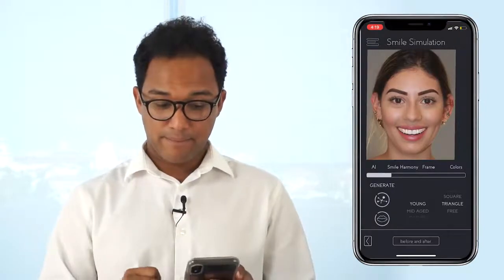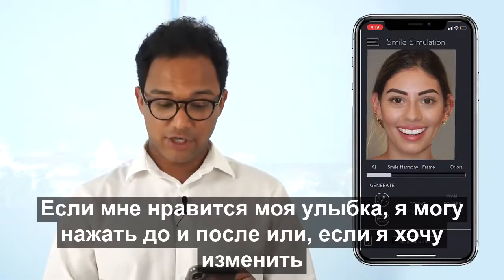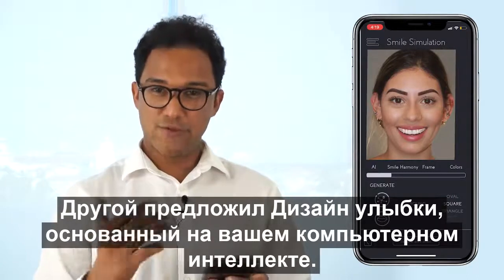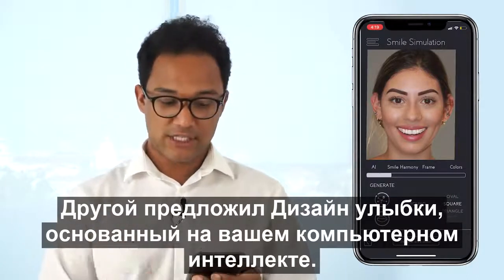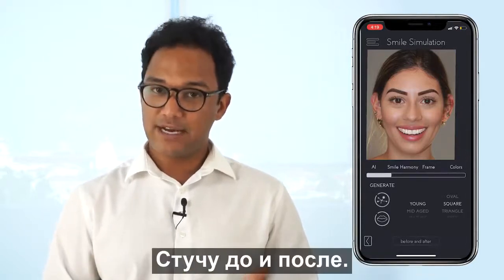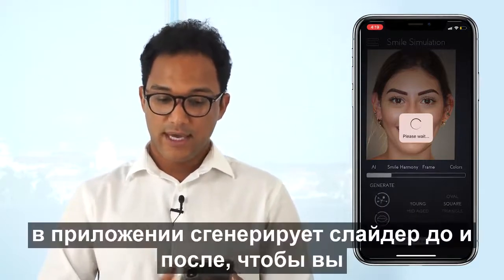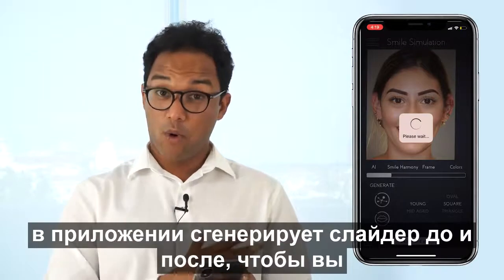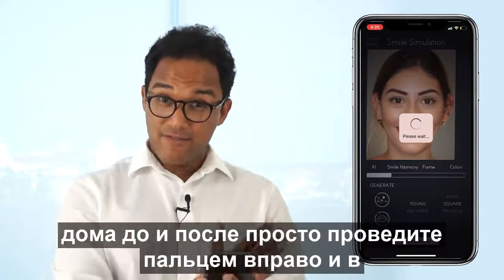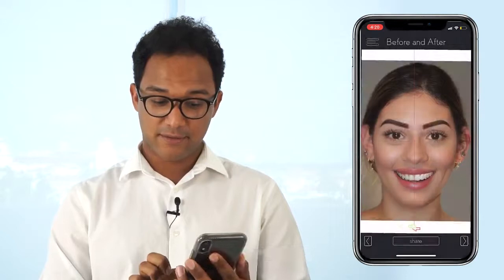facial shape. If I like my smile, I can tap before and after, or if I want to change to another suggestive smile design based on the artificial intelligence, I can tap on the Generate button. I tap before and after, and the app will generate a before and after slider. For you to have this before and after, just slide your finger to the right and to the left.